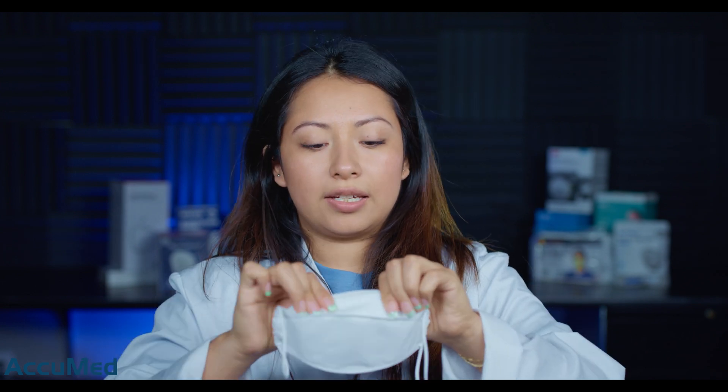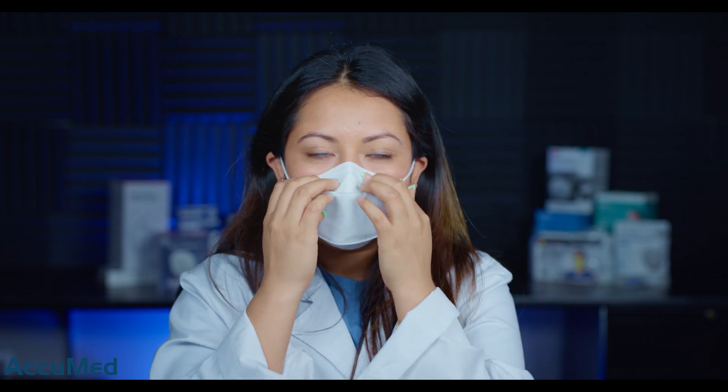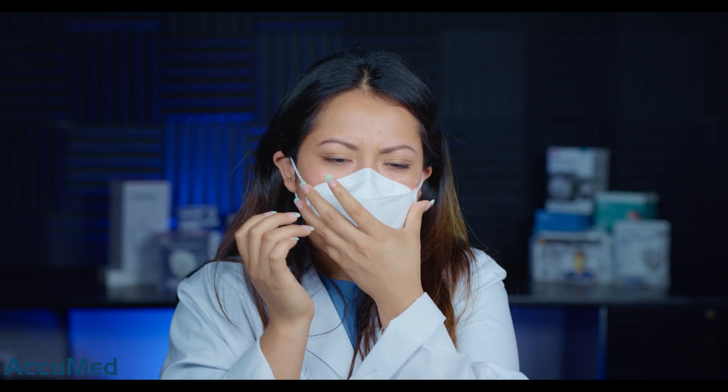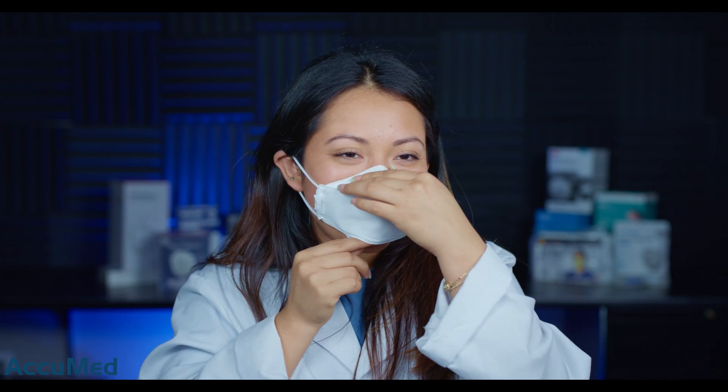Let's go ahead and open another one to try it on. The first thing I noticed while putting it on is that this one actually has a smell — it's kind of like a blend between plastic and metal and it is quite strong. It does have a pretty good nose wire, I don't feel a lot of collapse, and it feels like a very breathable mask.